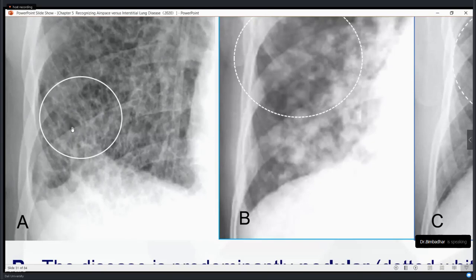Okay, let us say this is the bronchus. A bronchus looks like a little circular area, you see here, but the opacity surrounding it does not follow the same circular motion. It is actually crisscross lines. So by this I can understand this is not a pulmonary marking, but indeed a reticular marking.